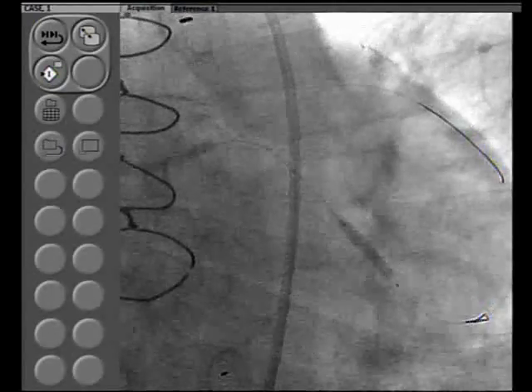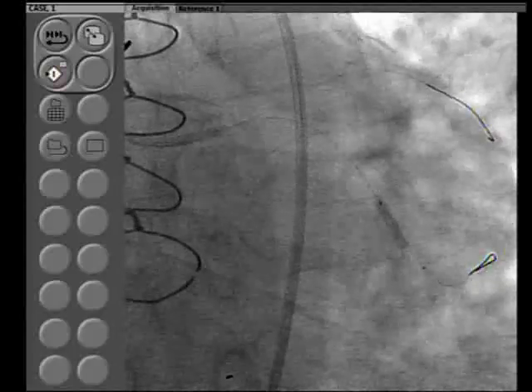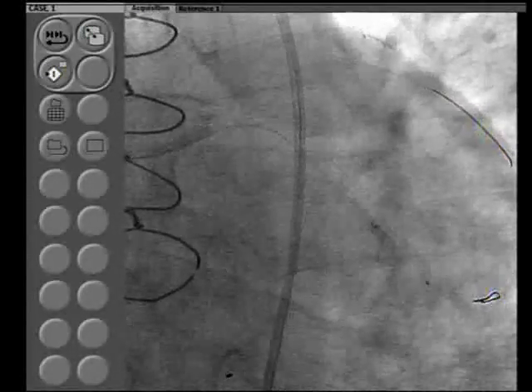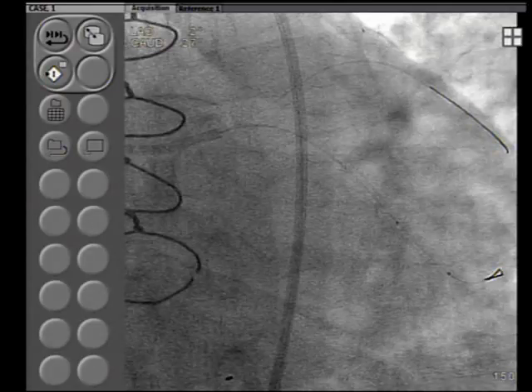Have to go a little distal again. Select the stents, I think SKS is the best way here. Go 2 millimeter distal. The same, very low, 2 atmospheres, just for a few seconds. The distally.